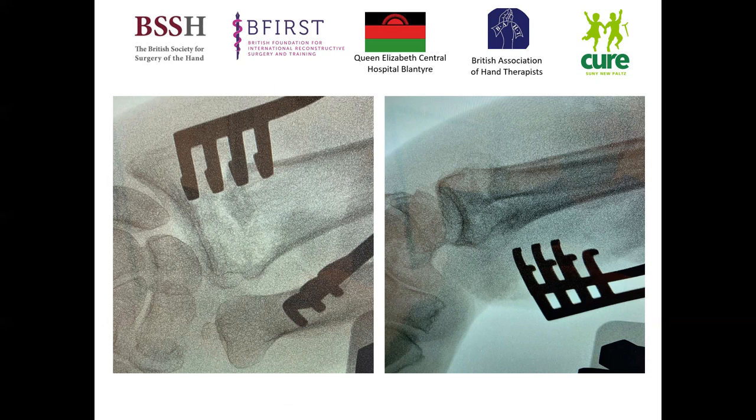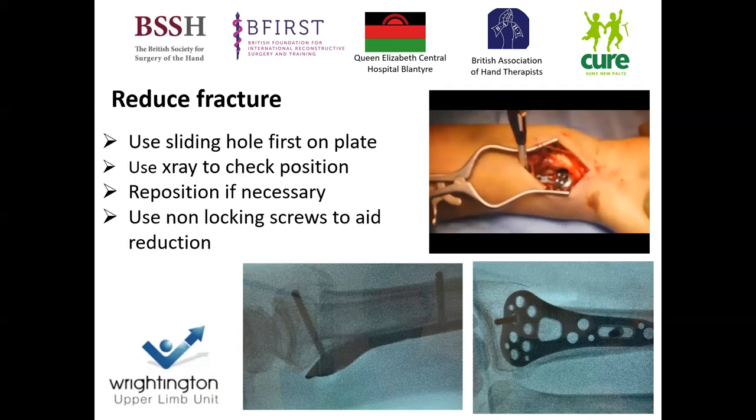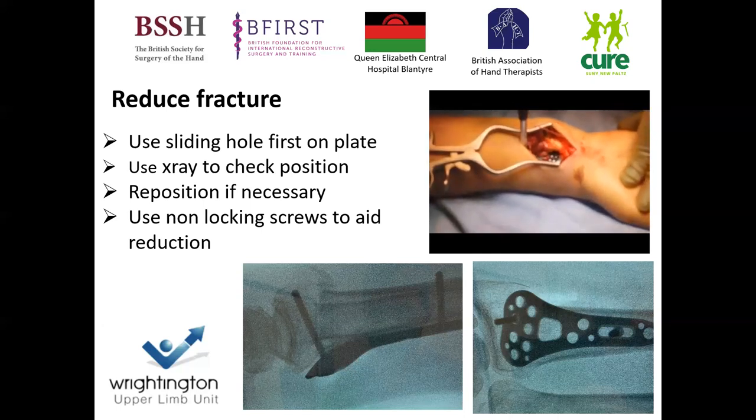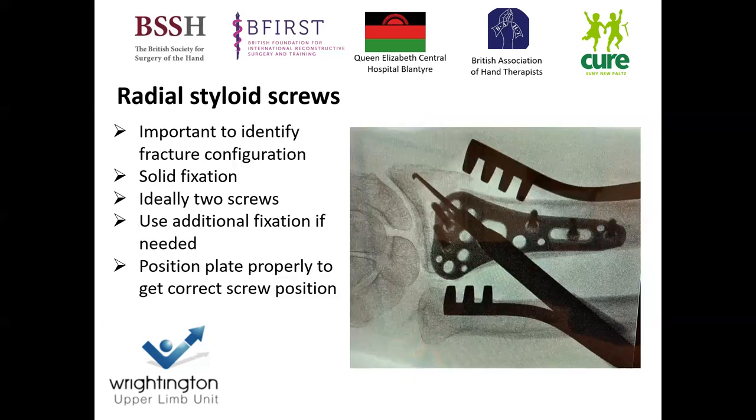You can see we've reduced the fracture back into position and checked our angles. There are also ways of using the plate to aid reduction. Here we've used the sliding hole of the plate and reduced it down with a non-locking screw. We then position the plate distally to get a non-locking screw engaging the dorsal cortex to aid that last bit of volar tilt reduction — using the plate and screws to help achieve reduction — then fill the remaining holes with a locking screw configuration.